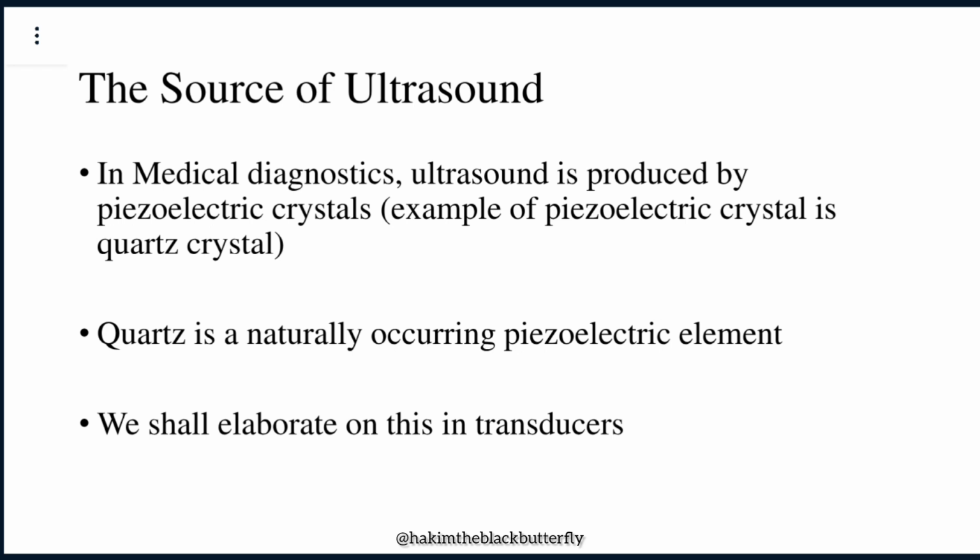Then those echo voltages are taken into other systems of the machine, analyzed, and then the image is formulated on the display.